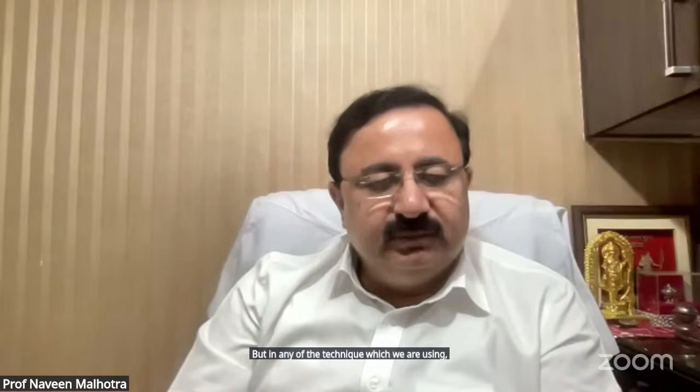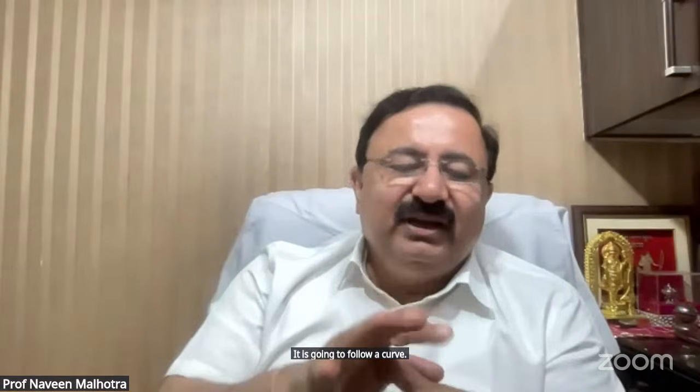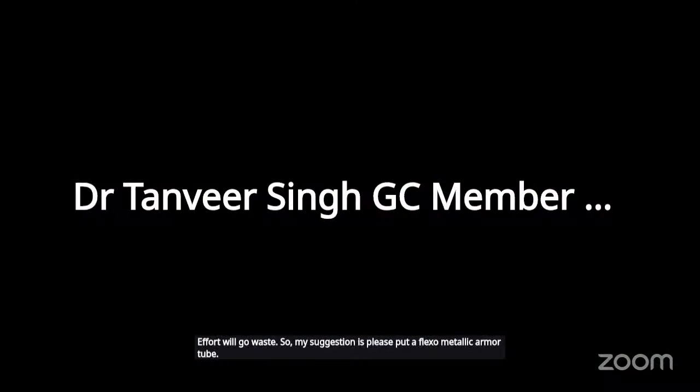But in any of the techniques which you are using, retromolar or submento-tracheal intubation, it is going to follow a curve, and if it kinks, then the whole effort will go waste. So my suggestion is please put a flexometallic armored tube.